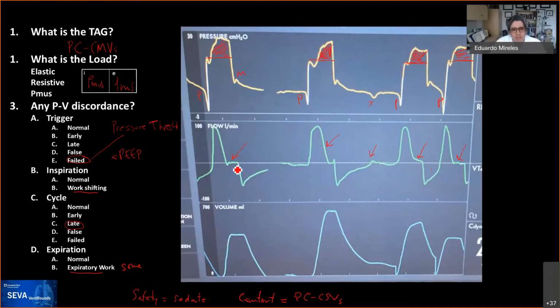As you can see here, what this is telling you is that this patient is not exhaling, that we have the valve closed. Even though he has finished, the valve is closed. I don't care what the patient is doing, we're not going to let the flow go out. That's why you see no change in flow during that period of time, which means your system is going against your chest wall, and your lungs are trying to recoil against a closed valve, and so you see the pressure rise up.